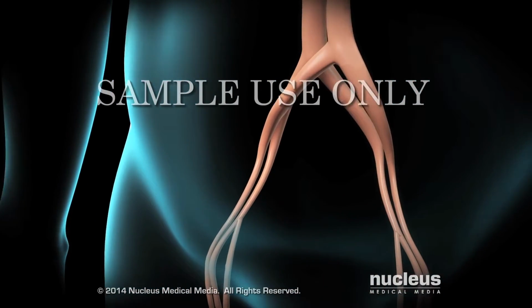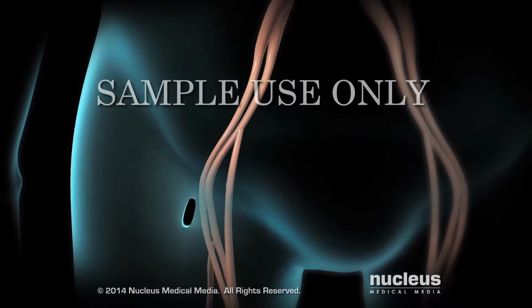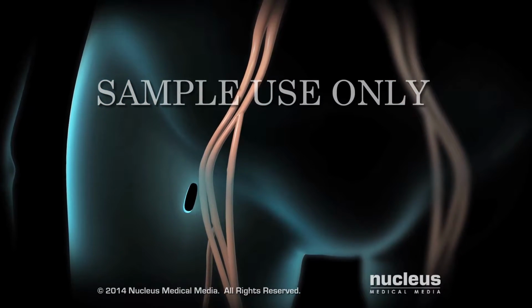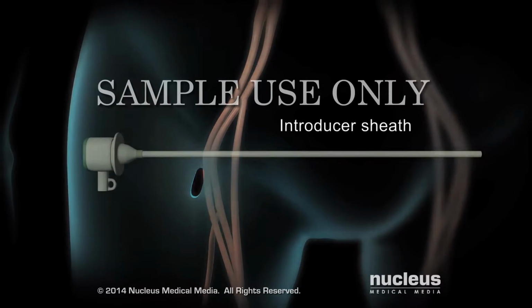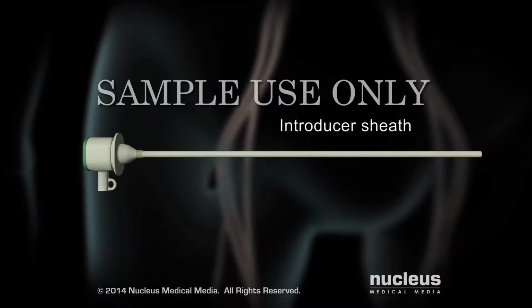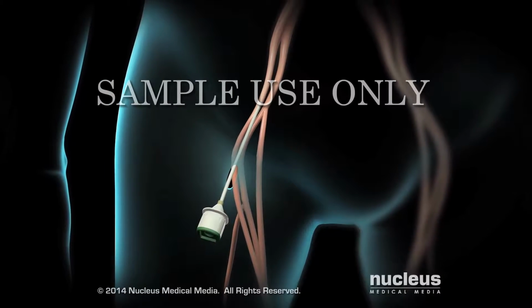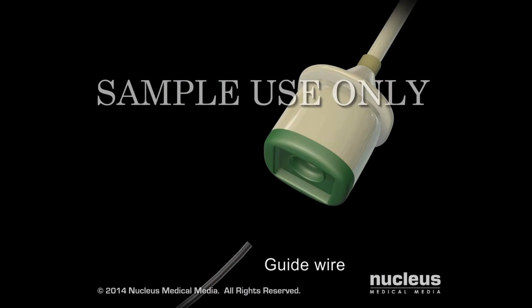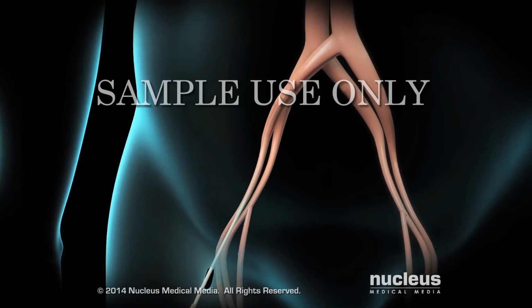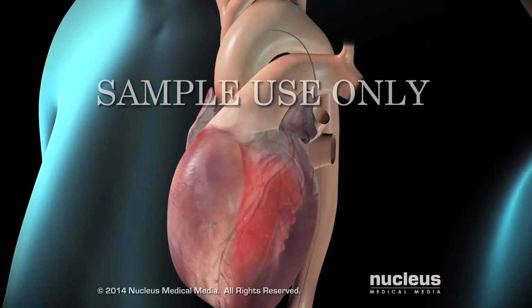At the beginning of your procedure, your doctor will make a small incision in your groin. After creating an opening in a blood vessel, called the femoral artery, your doctor will insert a flexible tube called an introducer sheath. Through the sheath, your doctor will insert a flexible guide wire into your femoral artery. The guide wire will be passed through your femoral artery all the way up to your aorta.